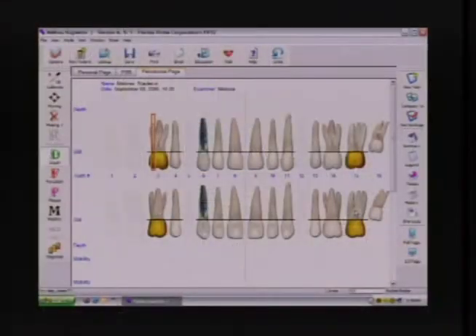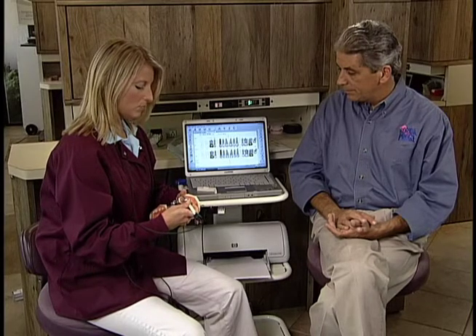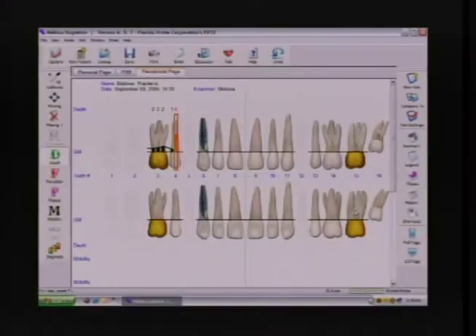So we insert the tip, contact the free gingival margin, and step. 2. Next site. 2. 2. 1. Danger. 8. Made the first mistake. Just stepped too early. Let's undo and reprobe, making sure that you're in contact with the margin.